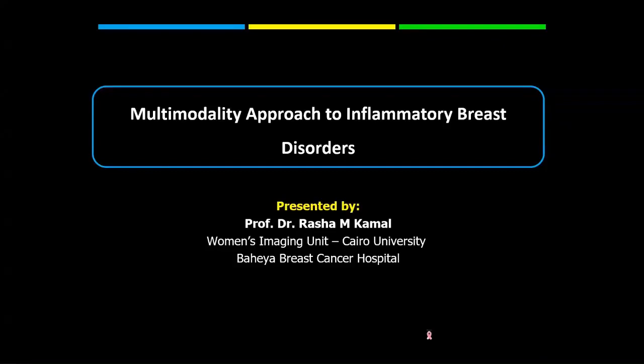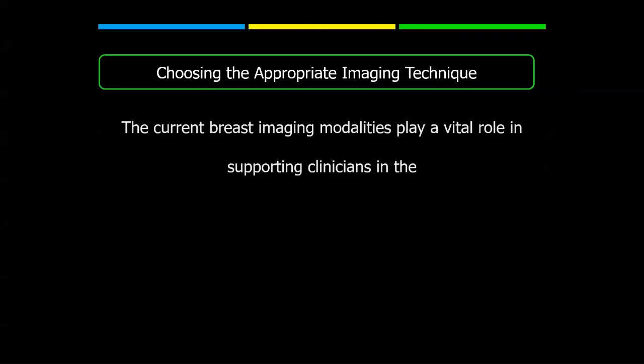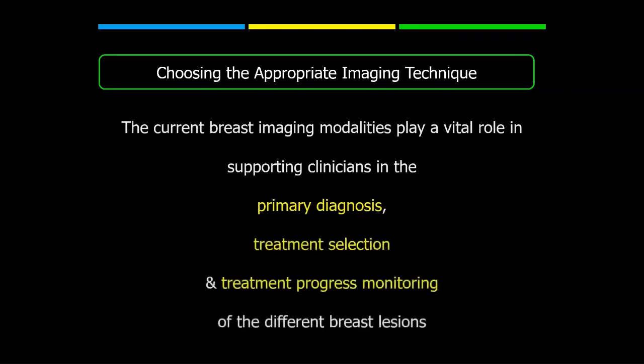My presentation today is the multimodality approach to inflammatory breast disorders. The current breast imaging modalities play a vital role in supporting clinicians in the primary diagnosis, in treatment selection, in the treatment progress and monitoring of the different breast diseases.